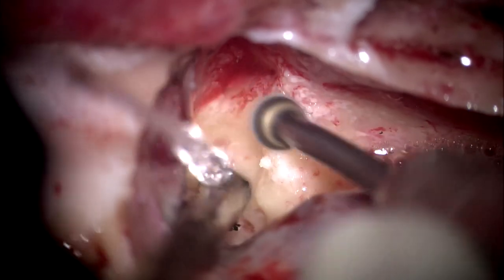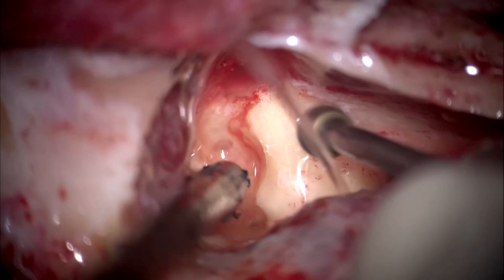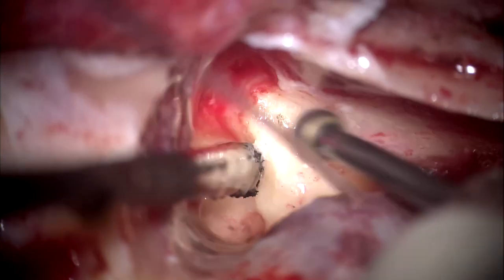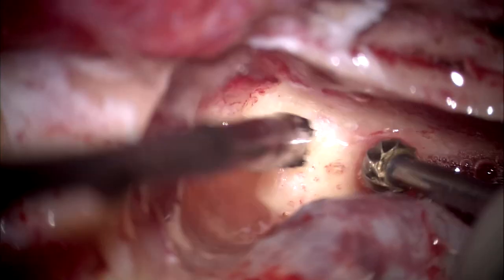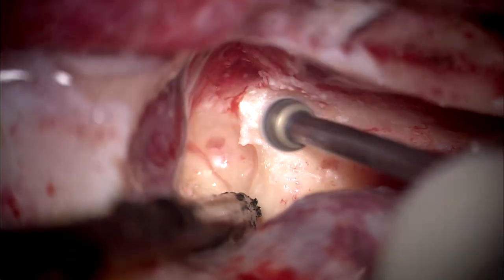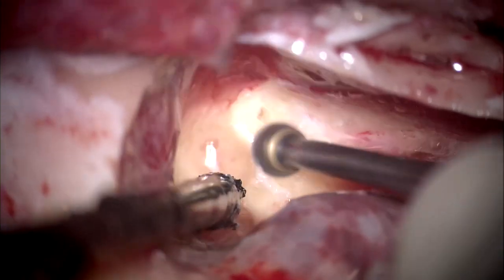To orient you further, see my facial nerve is there. See the facial nerve? See the facial nerve now there? Visible or not? Yes, very visible. In relation to the lateral canal, this is the facial nerve. I am drilling away. See both the ampullary and non-ampullary end you saw yesterday? Remember?